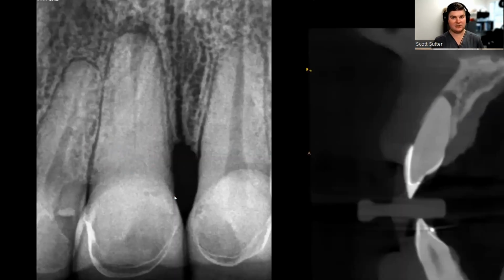The other thing you can do is, here's another case where once again, really high dental IQ patient. She's a dental assistant at one of my referring offices from a couple hours away. And she had just had these beautiful veneers put on top of there. Here's the problem. Where's my access going to be? It's going to be right through those beautiful veneers. And when you're accessing cases like this, you do need to have straight line access to be able to find them in the anterior. A cingulum access here isn't going to help you find anything. You've got to go straight down there.